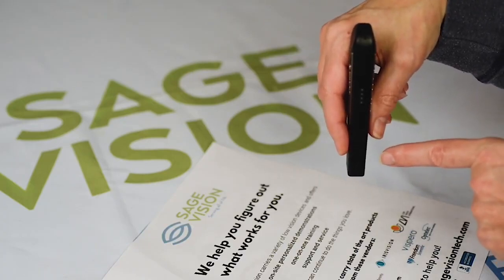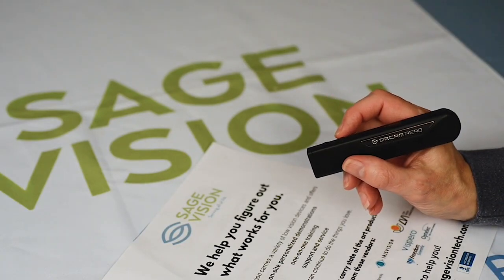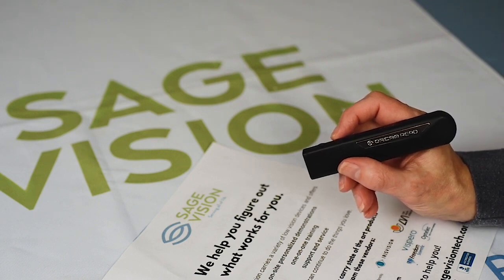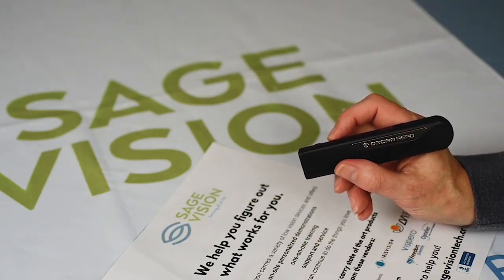Very easy to learn. The OrCam Read is perfect for all ages, from students to seniors, and it's easy to carry around — put it in your pocket, your backpack, or your pocketbook. We proudly carry the OrCam Read and we'd be excited to talk to you about it. Thank you.